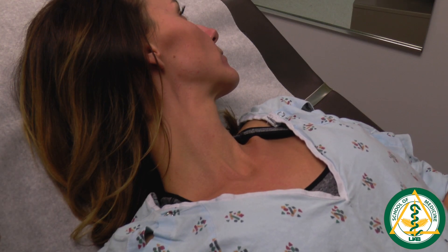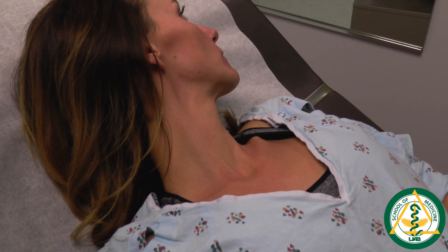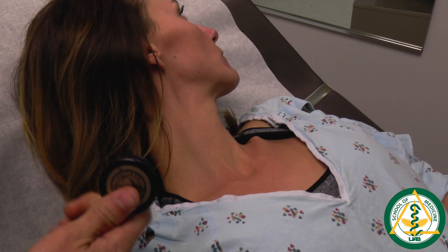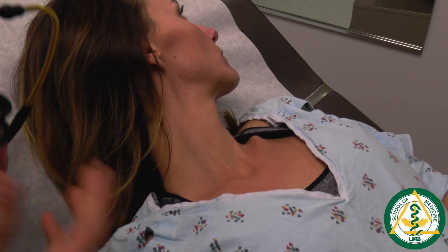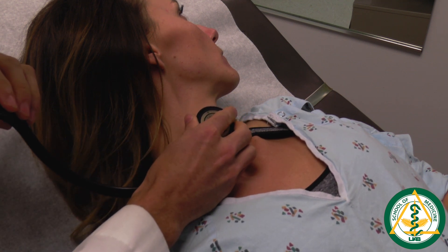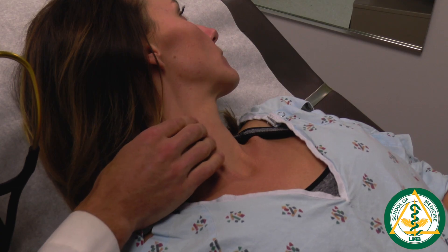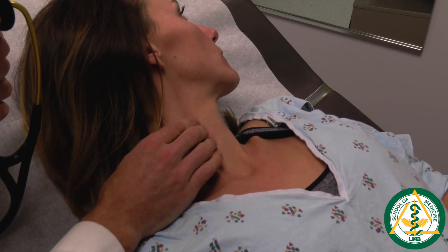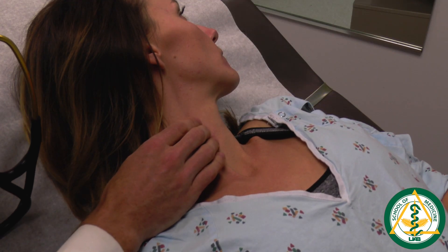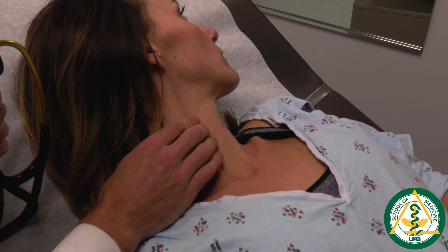Moving on to the common carotid arteries, the first thing to do is listen before palpating. We're listening for a turbulent, blowing sound that might occur if there's plaque formation inside the carotid arteries. We listen first because we don't want to palpate and dislodge any plaques. I'll use the bell side of the stethoscope since this is a low-frequency blowing-type murmur. Not hearing anything, so we're safe to palpate. I'm feeling within the groove just medial to the sternocleidomastoid, noting the amplitude — the strength of the pulse — and the contour, meaning how quickly it develops and diminishes.